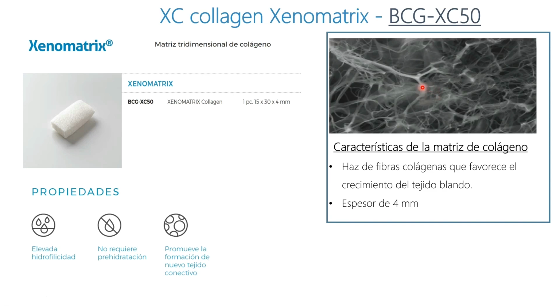Here we see an electron microscope view, where we see the interlaced collagen fibers that constitute the BCG XC50, which is derived from equine tendons.